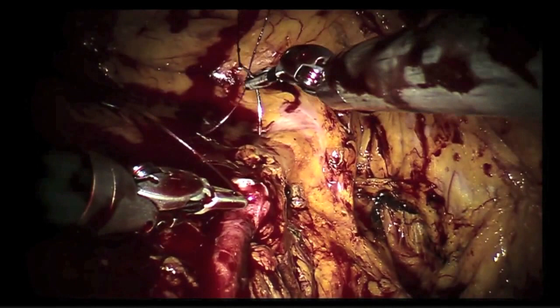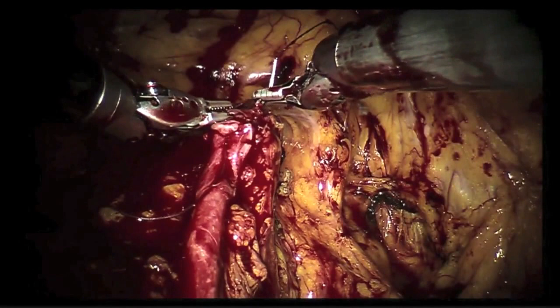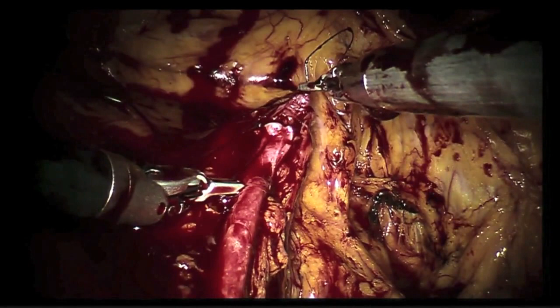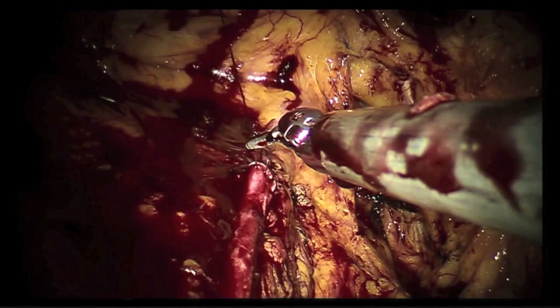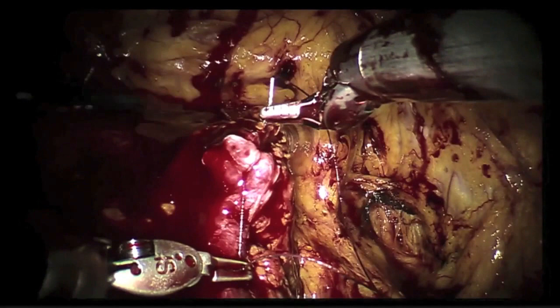No, definitely. I think this is a very delicate surgery. The only thing I'm grabbing is the bladder mucosa, never the ureteral. Bladder mucosa doesn't care. We are not particularly rushing anything, yet it's coming along nicely. Anastomosis time was 20, 25 minutes. So open surgically, we could have done it maybe 5 minutes faster.